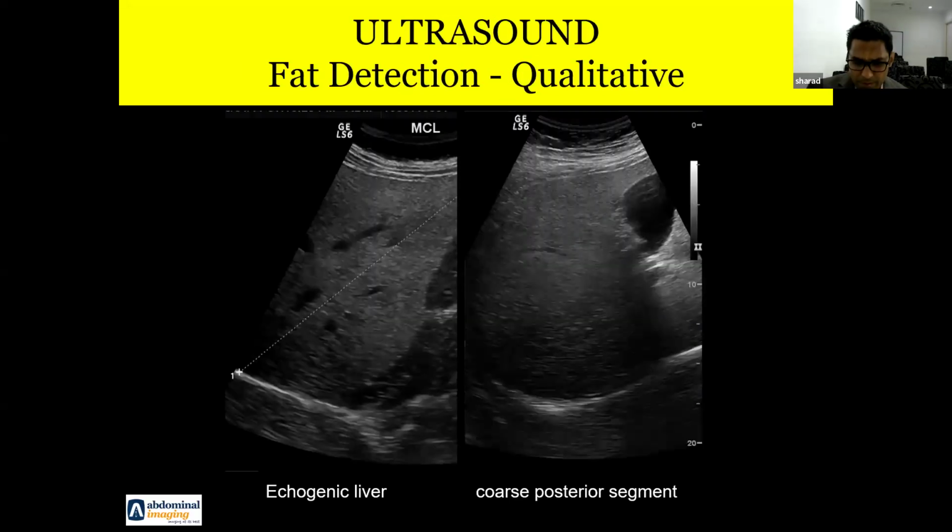Now, Dr. Rajas, we do preventive programs and Dr. Rajas is always there. So there are now quantitative methods also on ultrasound, newer machines where you take values from the liver and the kidney and they are able to quantify it in a better way. So I am sure in one of the sessions, Dr. Rajas will take that also.